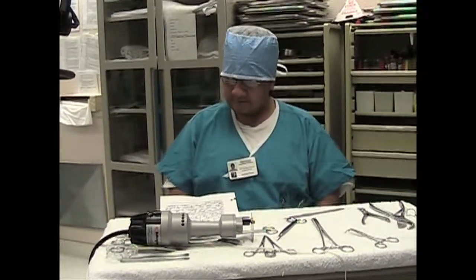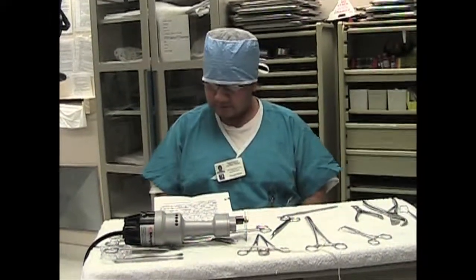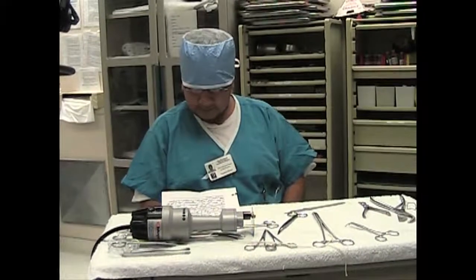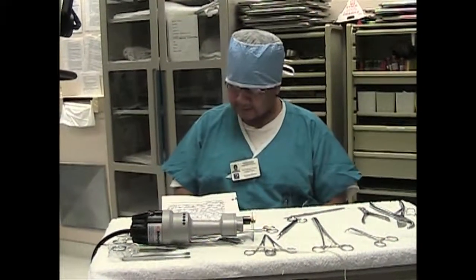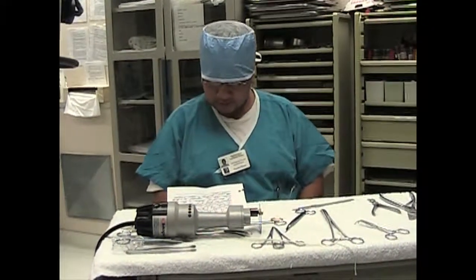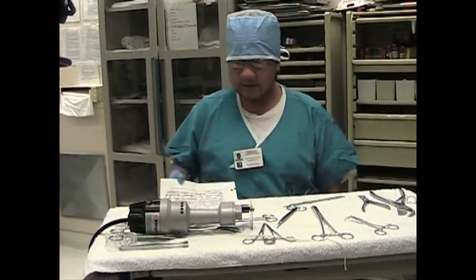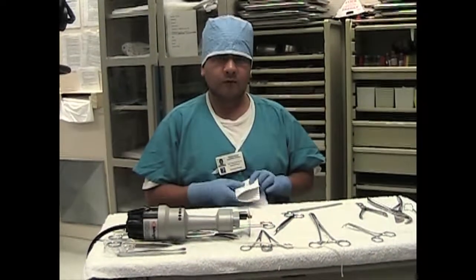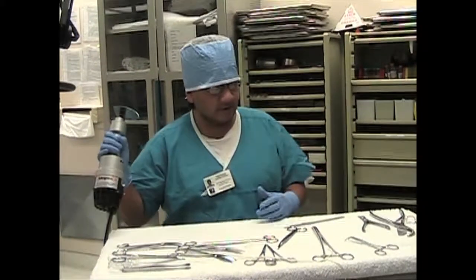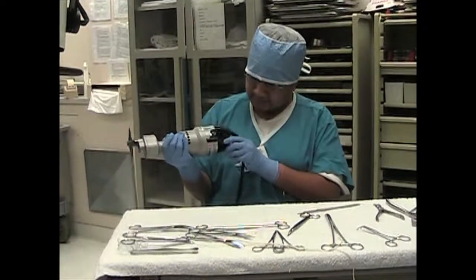The striker saw is highly efficient in the cutting of casts and other hard surfaces, but yielding surfaces or materials are not cut or injured. In the event the cutter should accidentally contact the skin of a person, it does not cut fabrics or other objects unless they are supported by a fairly rigid backing. It's one of the most important tools that we use here, along with the scissors, scalpels, and forceps. And this is what a striker saw sounds like.